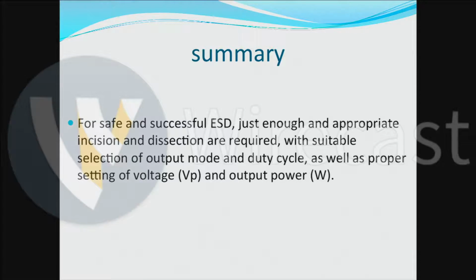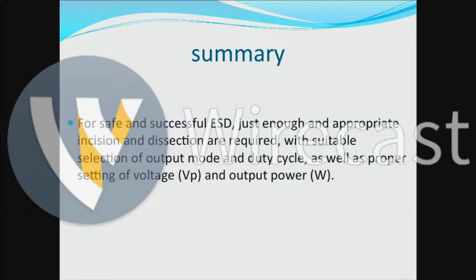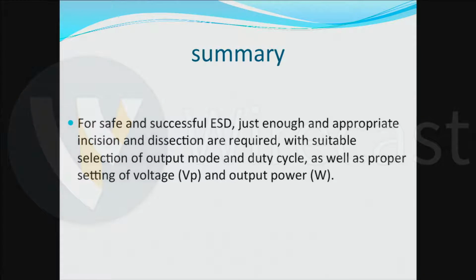Do you both prefer the forced coagulation? During my lecture I will explain about that, and pre-coagulation with the needle knife, with the former soft coagulation mode. But right now, forced coagulation at 110 watts, right? Yes. And the other doctor used the knife itself with the spray coagulation, right?